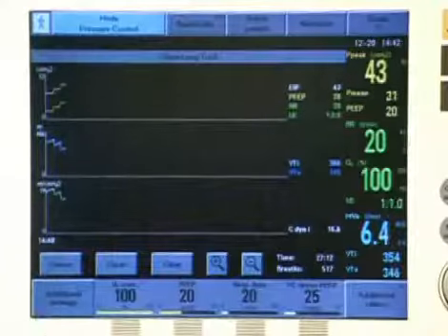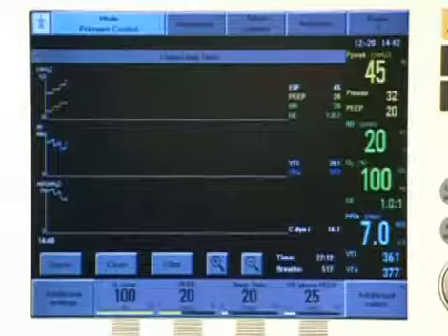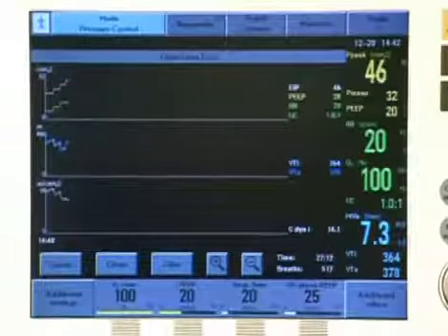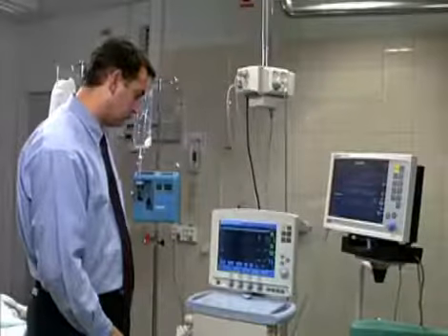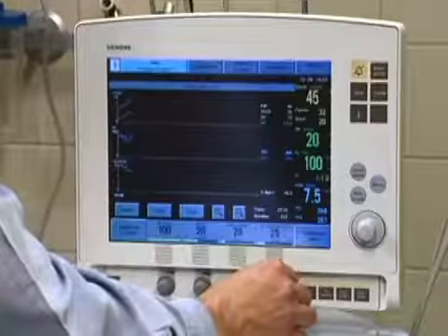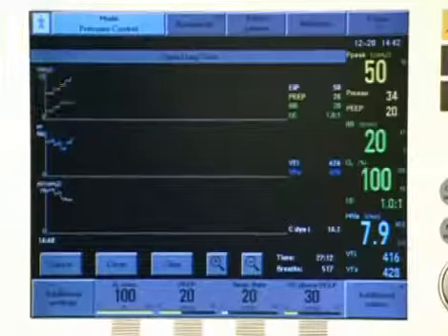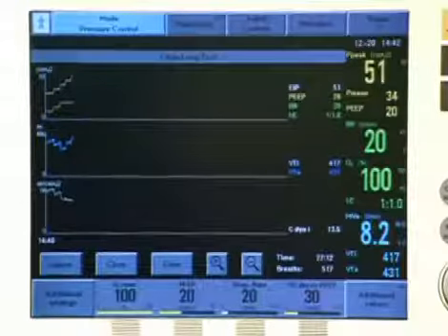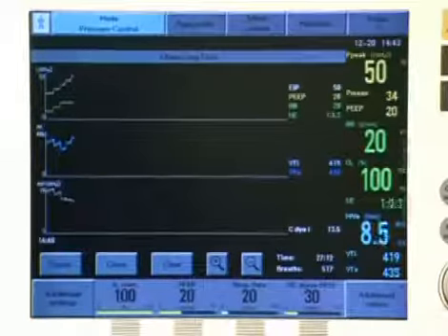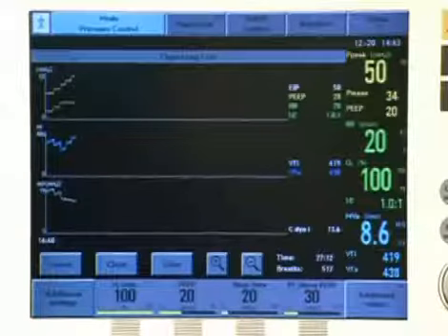The pressure above PEEP is first increased 5 centimeters of water, resulting in a plateau pressure of 45 centimeters of water. In the next step, the empirically estimated opening pressure of this lung of 50 centimeters of water is reached. This pressure level is maintained for 2 minutes.